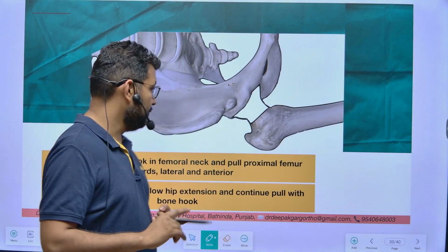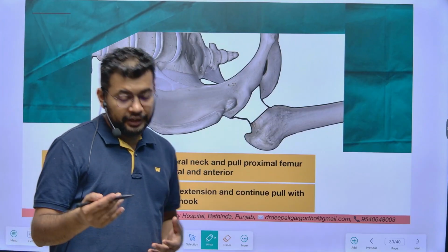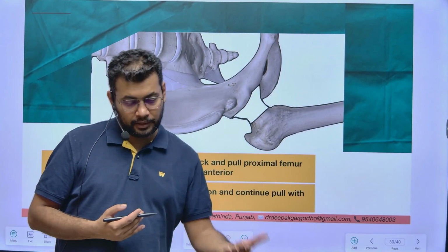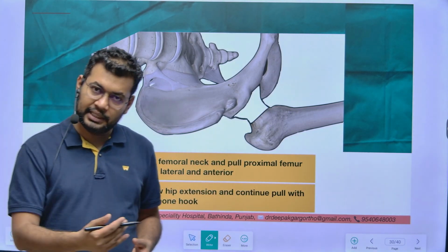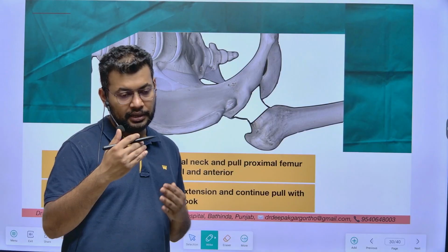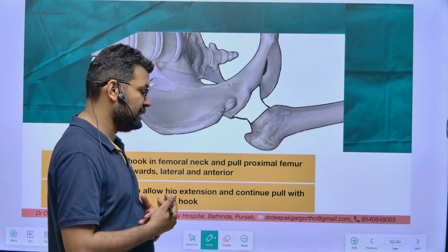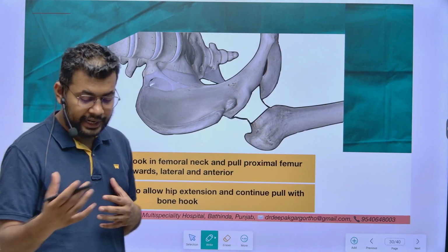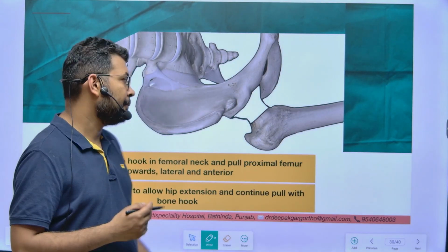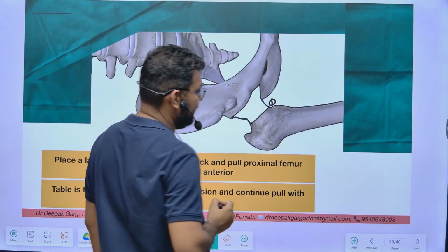Number 1, we have to put the patient in figure of 4 position, where the operative leg is below the non-operative leg, and we do adduction and hyperextension, and we put the breakable table into 30 degrees of extension, so that the hip is in 30 degrees of extension. Actually, the whole idea is we want to bring the femur out of the wound so that we can prepare the femur. So first, number one thing is we have to do the medial capsulotomy.